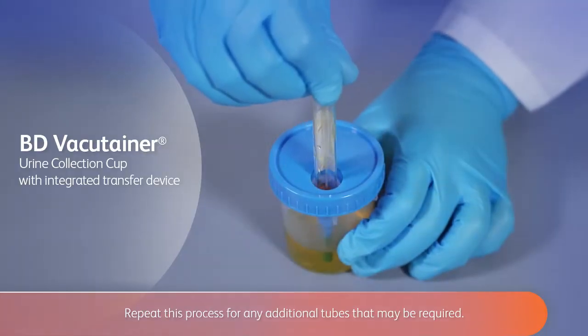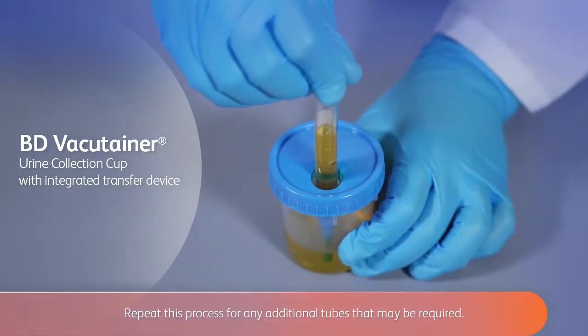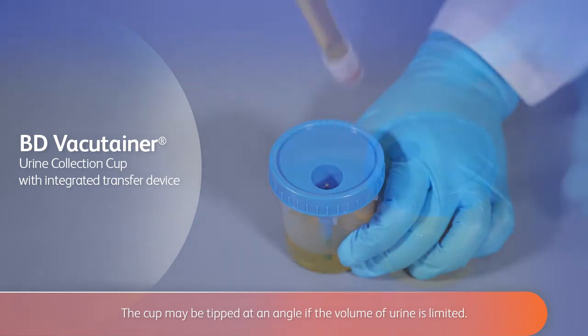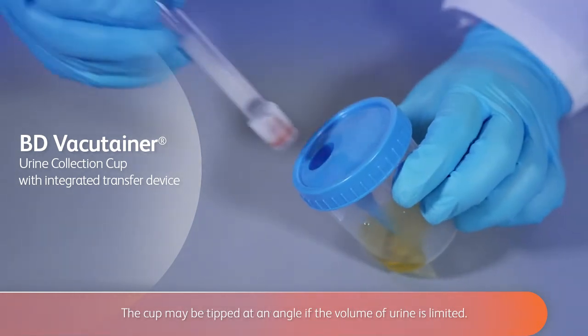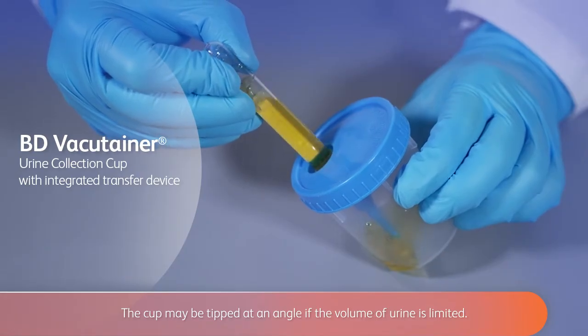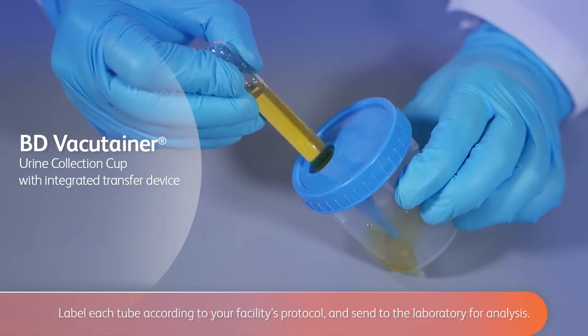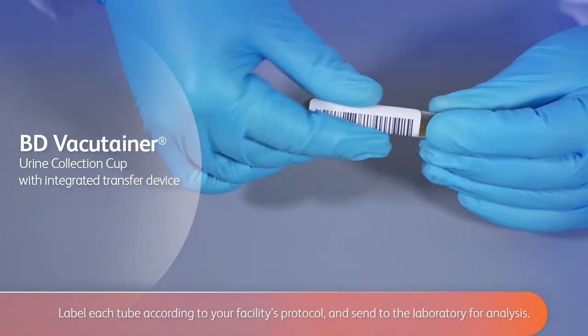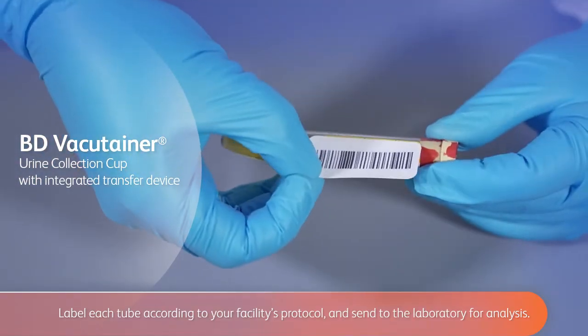Repeat this process for any additional tubes that may be required. The cup may be tipped at an angle if the volume of urine is limited. Label each tube according to your facility's protocol and send to the laboratory for analysis.